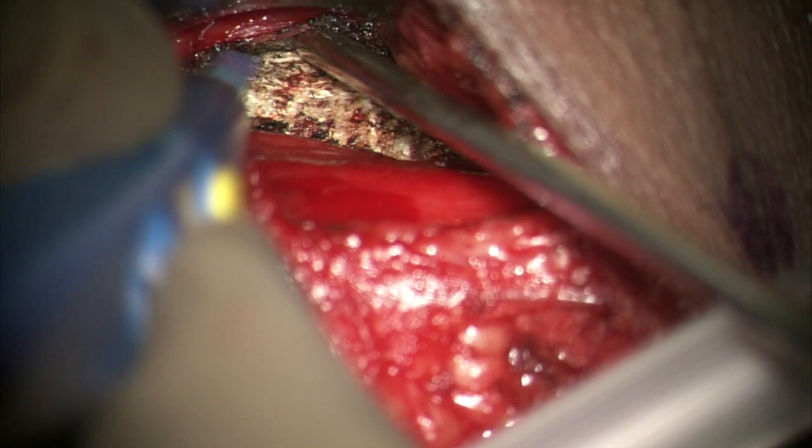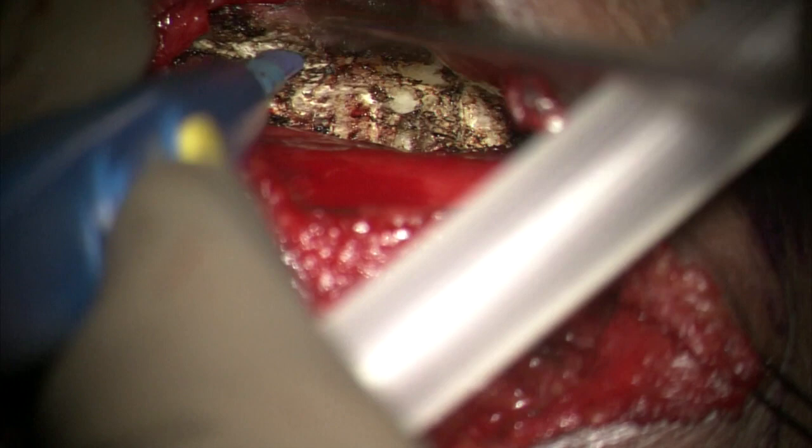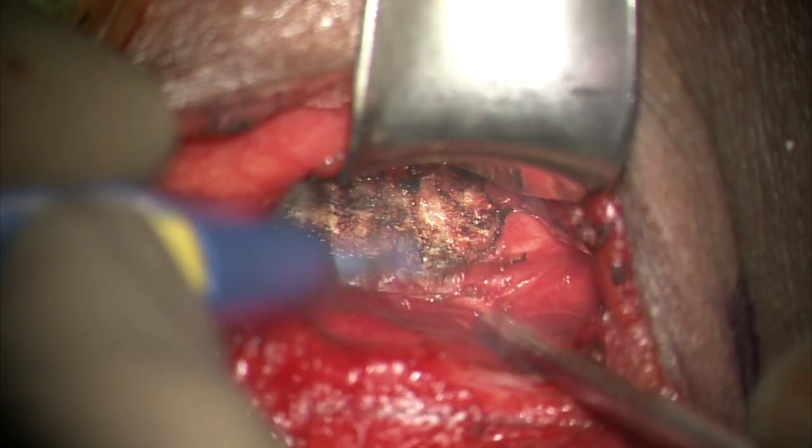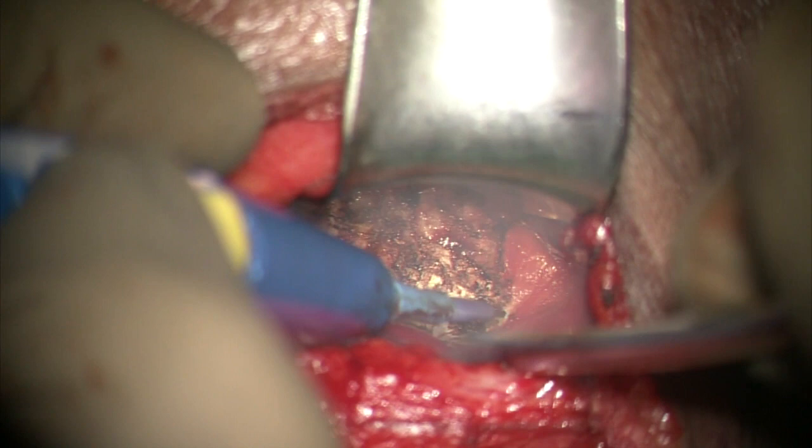Both longus colli muscles are elevated subperiosteally up to the uncovertebral joints, with the suction tip being used as a retractor. The vertebral artery is unprotected at the level of the disc as it does not lie in the bony neuroforamina, and extensive lateral dissection can endanger it. There are no blood vessels over the disc, but bleeding can be encountered from nutrient foramina that are usually located at the mid-body level.